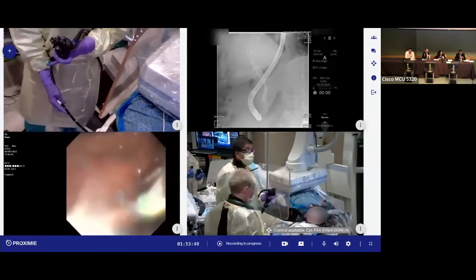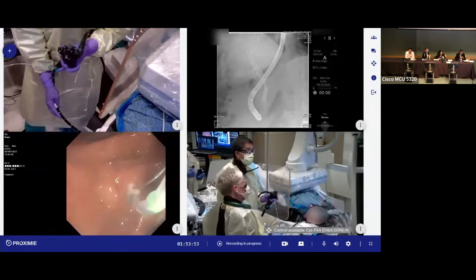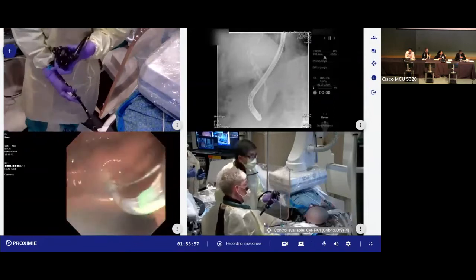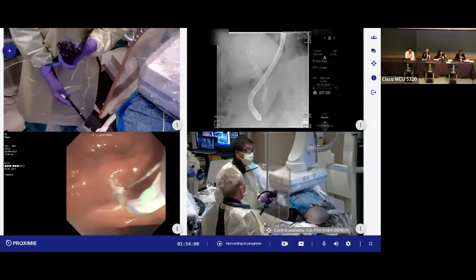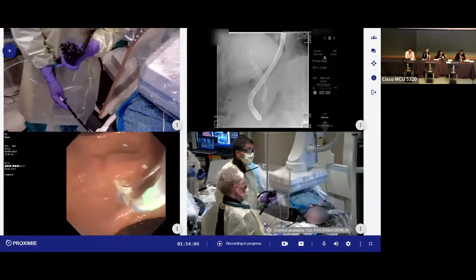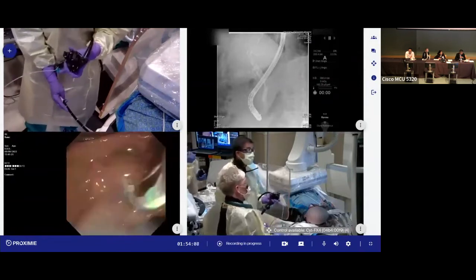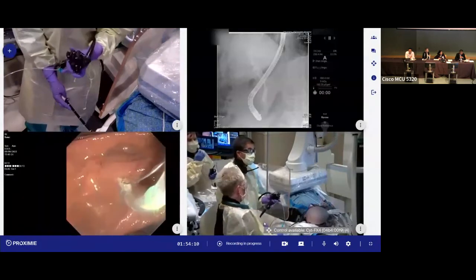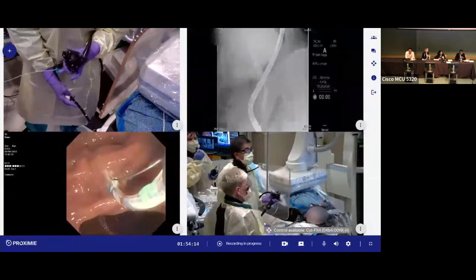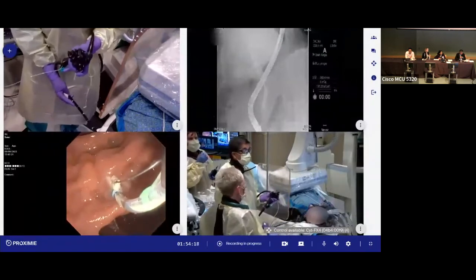We'll start at 131, and then we're going to use a 10 to 12 short CRE, unless you guys think differently. No, I more like that cautery than I'd like to see. That's the reason I went low to 131, but it might have been more an issue of pressure applied. Jeff, do you have a suggestion regarding that? Seems like a lot of cautery there. Yeah, you could tense up the tome a little bit more and maybe bring a little bit more out of the duct and just cut to the tip of the wire. Always try that. That gives you a little more of a, yep.